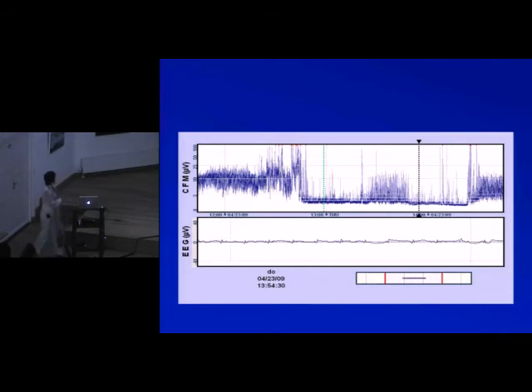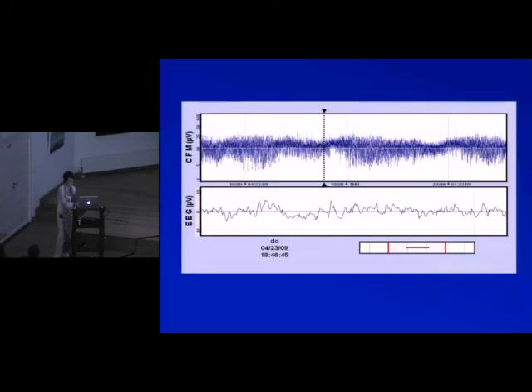Ultrasounds were normal. And here we see a sudden decrease in the EEG, almost a flat trace with some ECG artifact, as you'll see here. And it turned out that this baby had a tube blockage. And we couldn't see this immediately from the high frequency oscillations, and there were normal oxygen levels, so apparently nothing changed in the ventilator settings, but we found out that this was tube blockage, and there were very high CO2 levels in this baby, and when the CO2 levels returned to normal, so did the EEG, as you can see here in this baby.